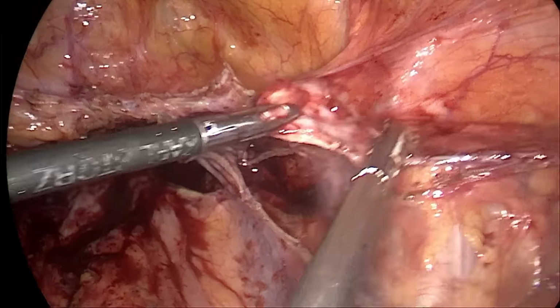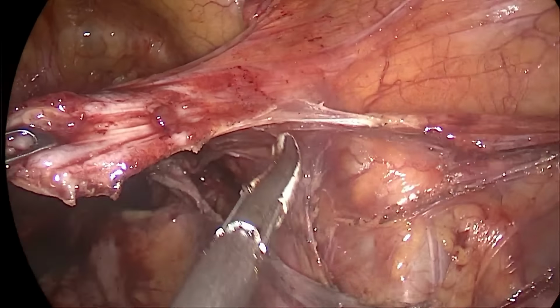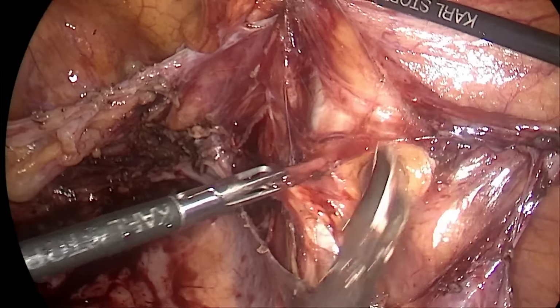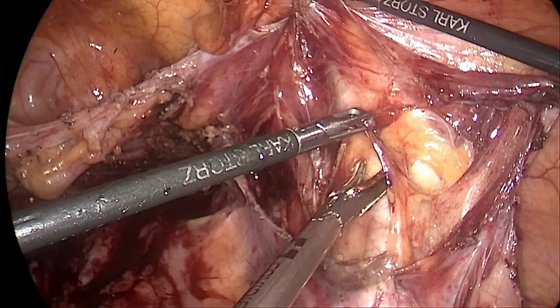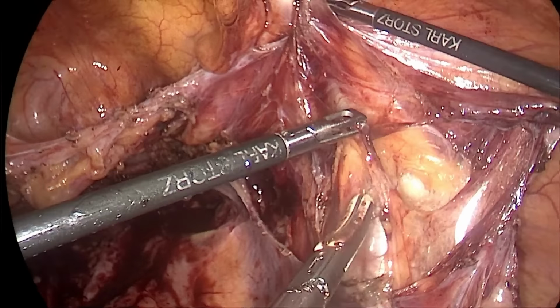So once the specimen is delivered vaginally, we are moving on with the pelvic lymphadenectomy on the right hand side first. Firstly, we are on the psoas major and taking all the lymphatics lateral to the external iliac vessel, towards the external iliac vessel.